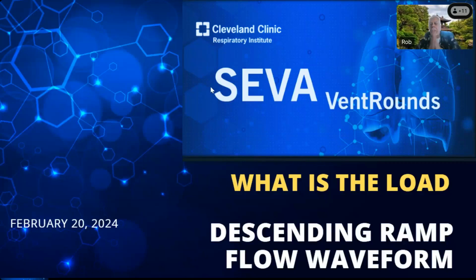So today we're going to talk about a particular form of volume control ventilation where people use a descending ramp.